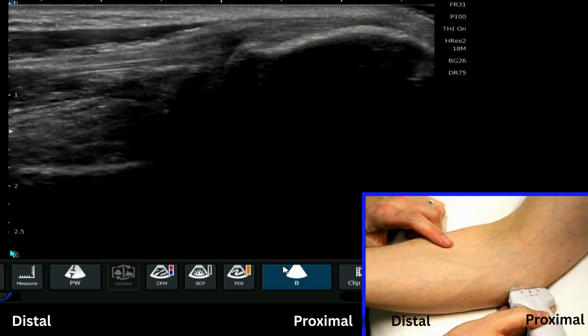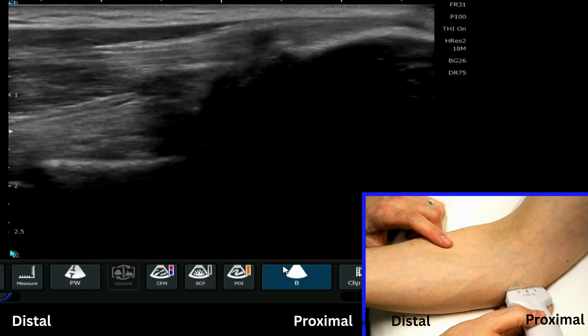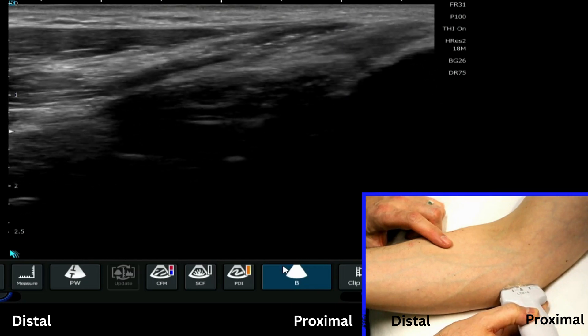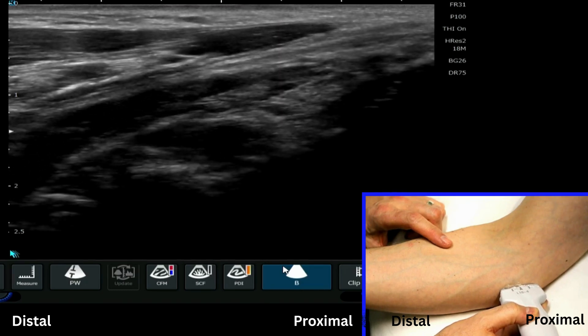In this image here we can see the common flexor tendon insertion, and if I move my probe a little bit more distally we can see that sort of comet tail of the intramuscular tendon here.